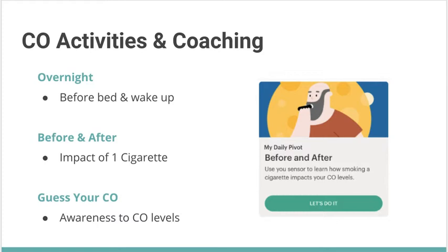Now, there are scripts around guiding users to use the CO activities, as well as scripts for post-quit. So for example, for post-quit, you might ask them, looking back, what was a typical CO reading for you while you were smoking? Or how does that compare to how you are today? Or how does it feel to see CO levels in the green? Or how are you going to continue to use the breath sensor to give yourself more time, more motivation to stay smoke-free?